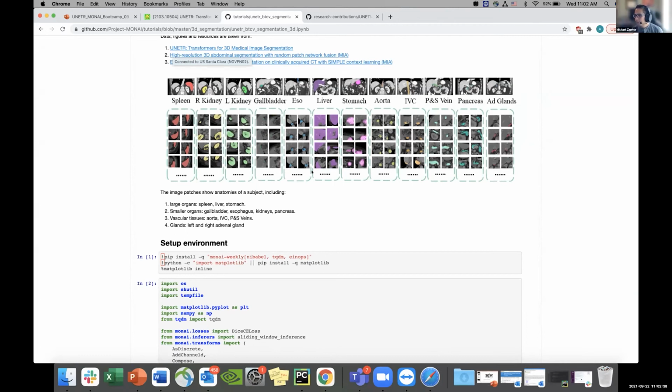Another one was whether it would be adaptable to 2D images easily. For sure. Our model also has a 2D version or implementation in MONAI. What you need to do is set the spatial dimension correctly to be able to use it for your 2D applications. In the paper, we did not explore that direction, but it will come out maybe later. We will post some tutorial about a 2D segmentation application, but for sure, it can also be applied to 2D segmentation applications as well.